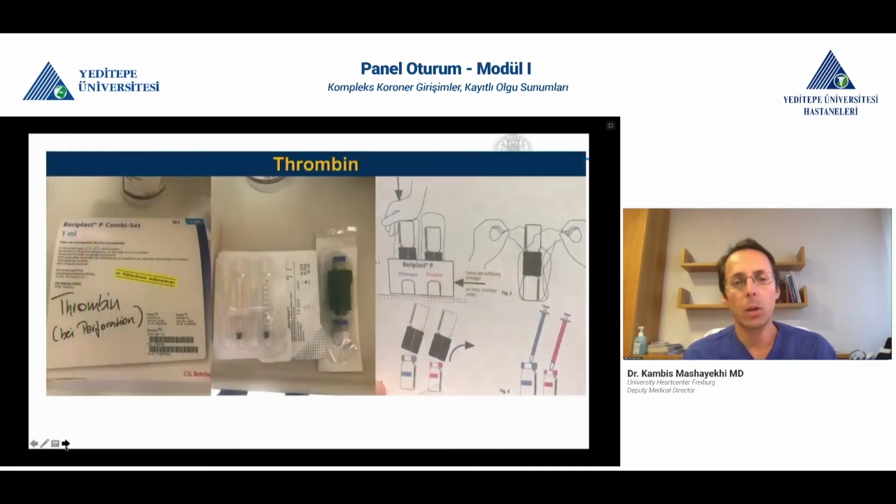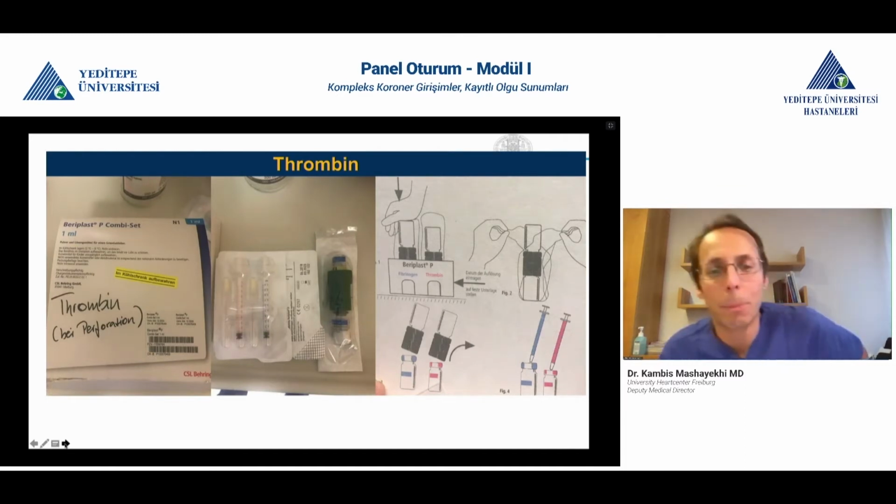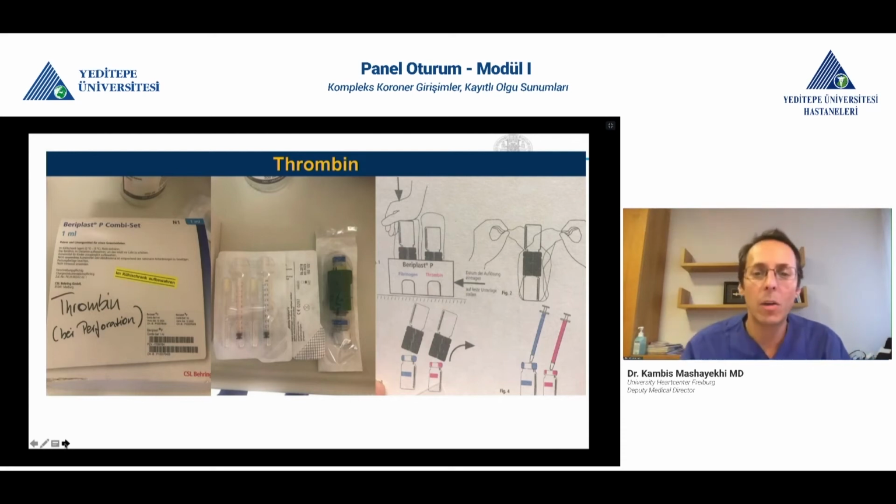For sure, you can also inject thrombin. So it's for the aneurysma spurium. We take the same one, we take the thrombin, fibrinogen and thrombin. So we take the thrombin out, and then we give per channel 0.2 to 0.4 cc very gently, and then flush very gently with water, like you know it from the TASH, from the transcoronary ablation of the septum. So very gently, and wait, and the effect will be good.